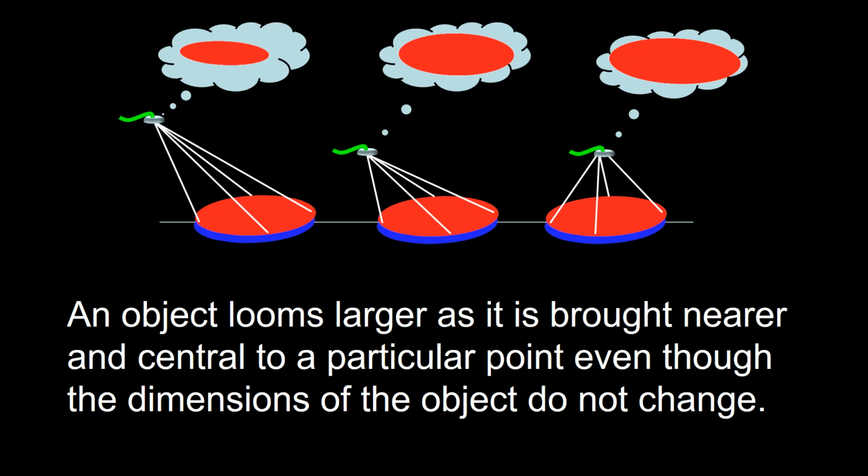In this frame, as you can see, the dimension of the circular structure at the level of the white line is the same, but their perception by the electrode is different depending on the spatial relation between the electrode and the object. In the figure on your left, the electrode is higher than the other two electrodes and it is also off-centered. Hence, the object to that electrode will look smaller than it would look to the other two electrodes.